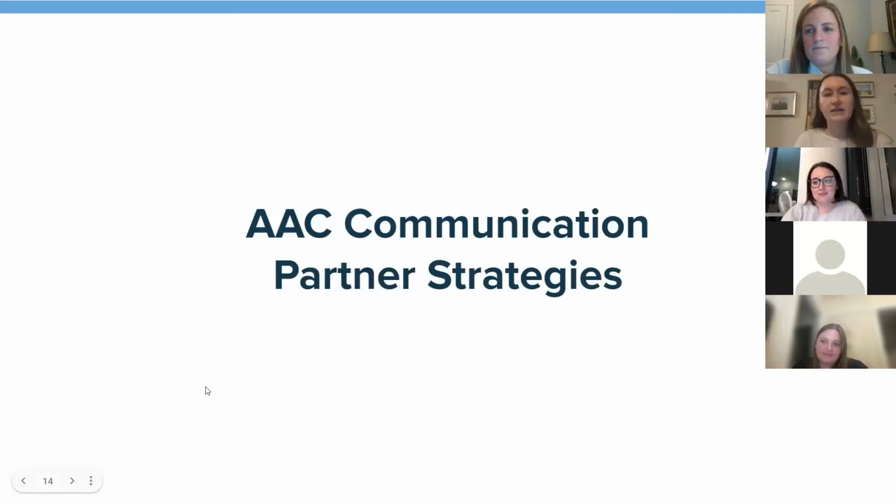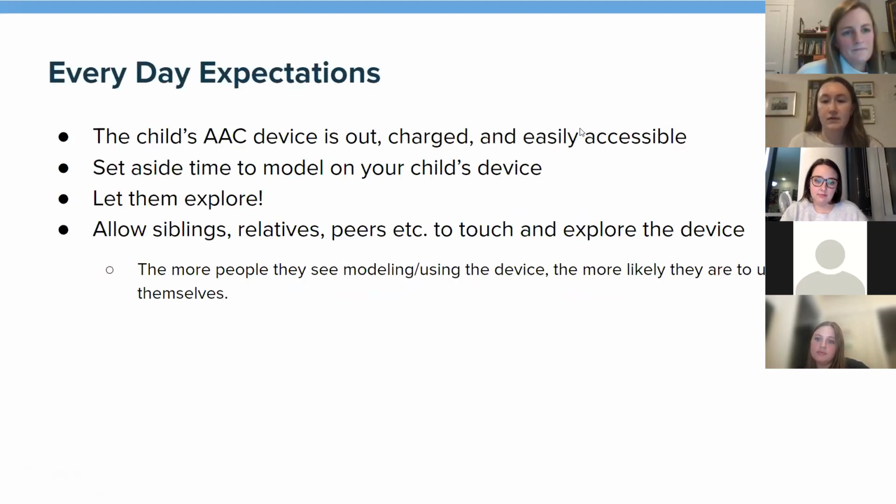All right, so like Elizabeth said, we are going to move into our communication partner strategies. So you guys as parents and caregivers are a major communication partner for our AAC learners. So as our AAC learners' main communication partner, there are some everyday expectations that will promote success with an AAC device.